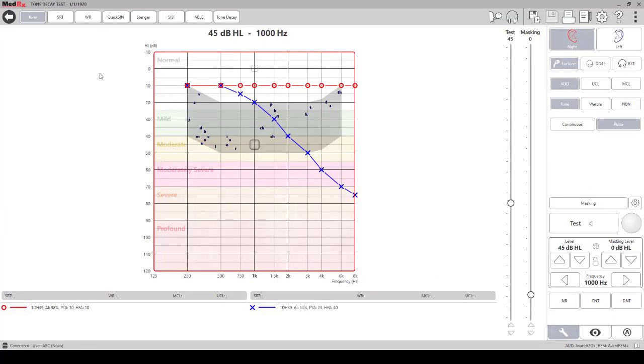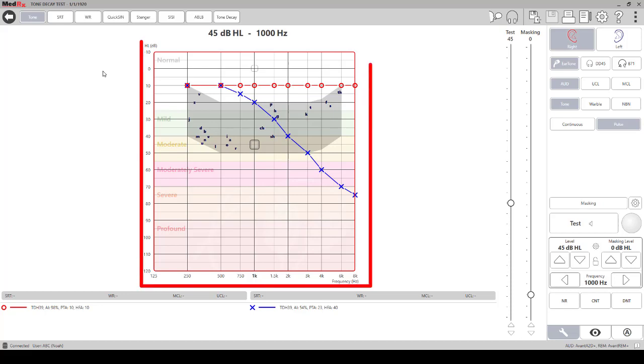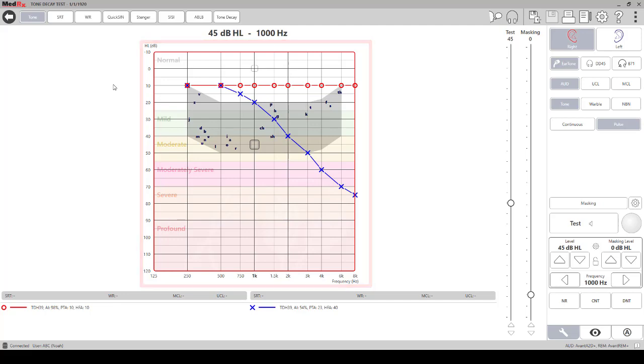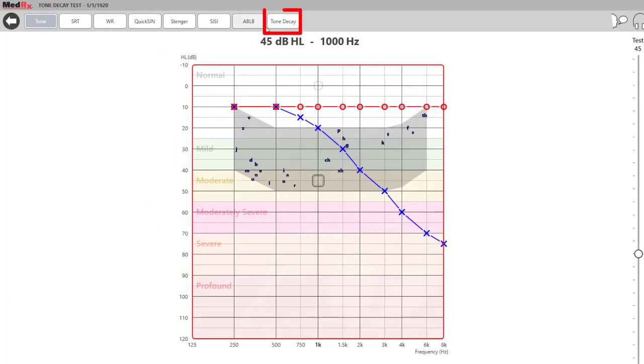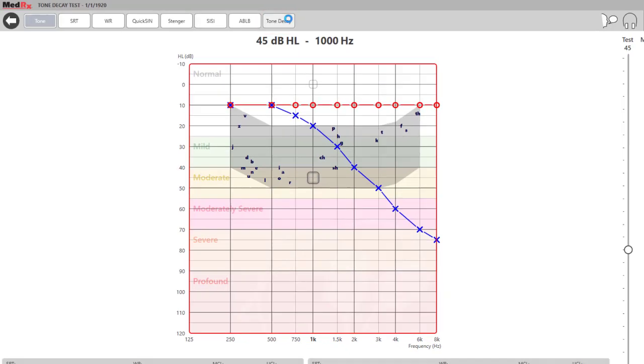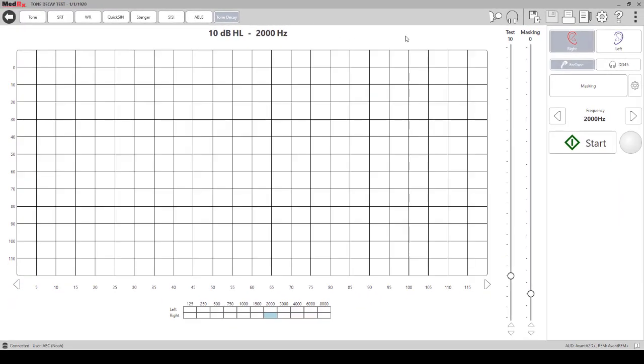On the tone screen here, you will see the thresholds that we used as an example when we were discussing the background. On the top of the screen, you will see a tone decay tab. You can click on that, and that will bring you to the test.